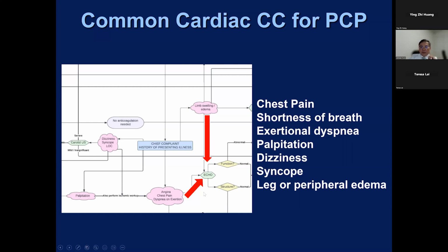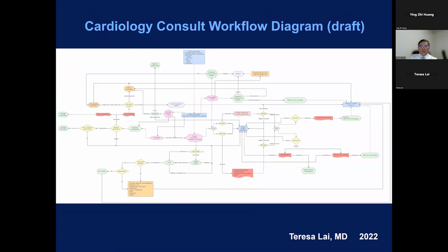And they either detect some abnormality or some changes, and the patient was referred to see a cardiologist. In the cardiology office, we do an echo, which is like bread and butter, and which allows us to see the function of the heart and to evaluate the various structures of the heart.